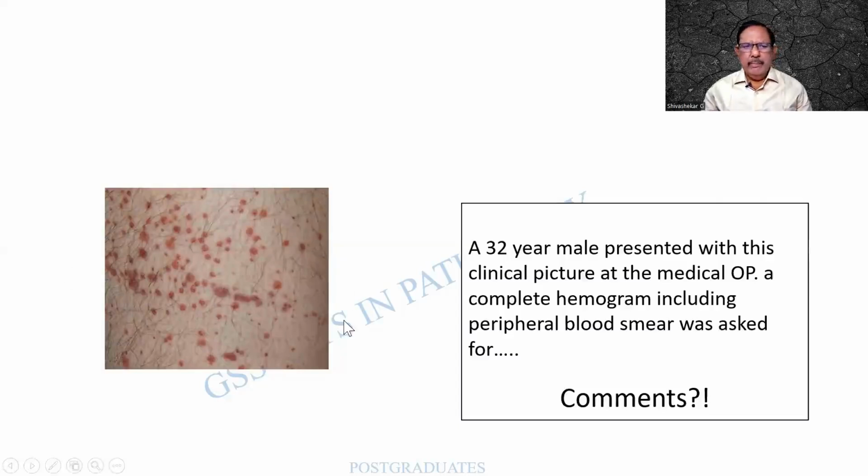I find that there are multiple small to moderately large blotchy areas of hemorrhage. Now at this point, I would like you people to kindly read up what is purpura, what is petechiae, what is ecchymosis, and what is frank bleeding. These are the different entities you will definitely be asked in the viva, in the bleeding disorders, and so on in your examinations. That having been said, I hope you are able to make a diagnosis in the context of bone marrow aspiration, in the background of hematology.